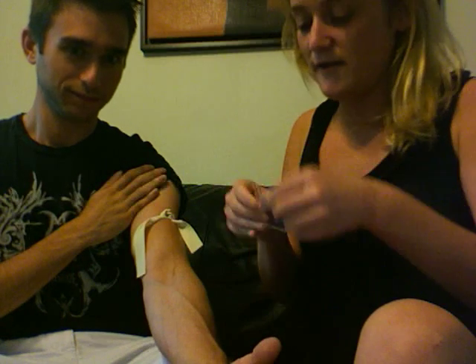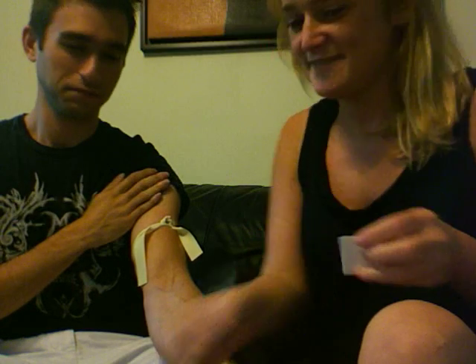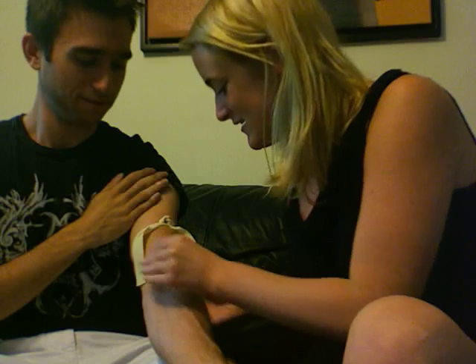So now I'm going to wipe it with alcohol. Are you nervous? No. Not even nervous? No, I trust you.